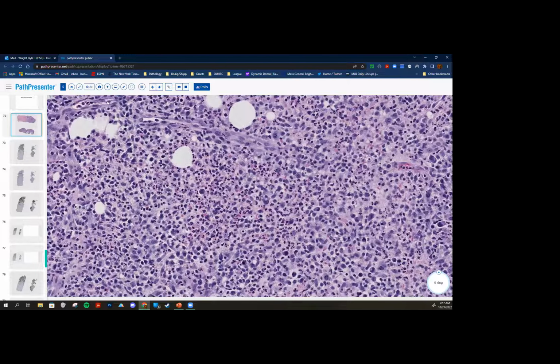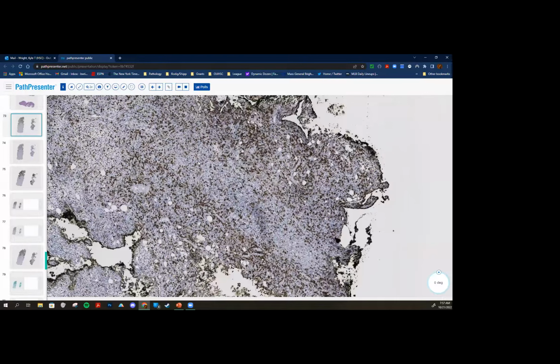Your slides aren't advancing. Oh, they're not. Can you see here? No, we're still looking at the H&E. I'm seeing the IHC actually, Kyle. So I'm not sure. Oh, there's a discrepancy. I am seeing you advance. Are you seeing me move in and out? Yeah, zooming in and out. I can zoom in and out. It might have been your computer not catching up.